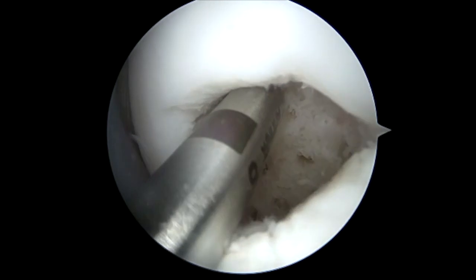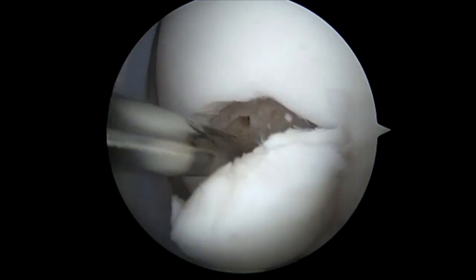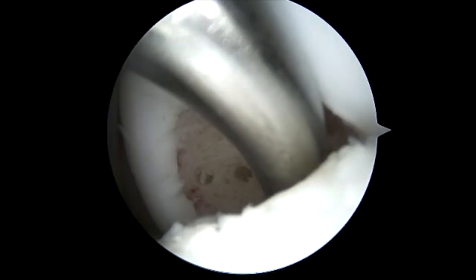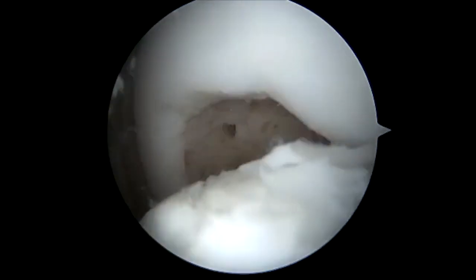You can see here we're trying to get the entire base of the OCD. You can also see we've maintained the medial hinge.